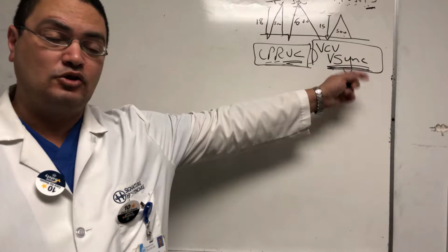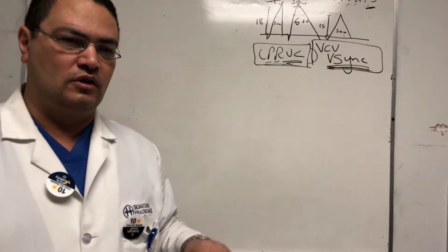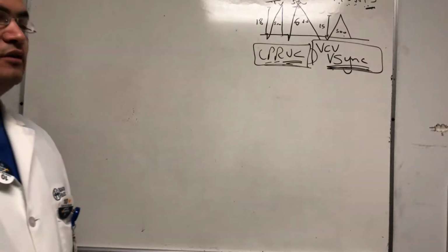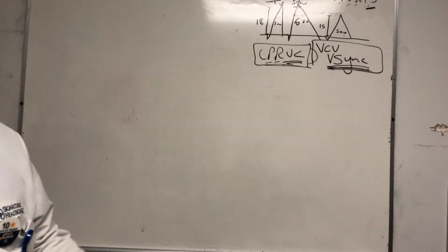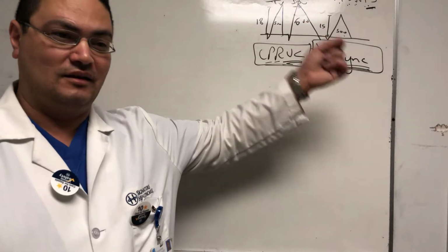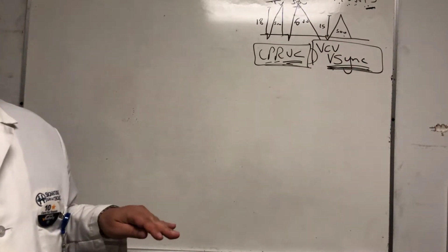It's not pressure control because you can't control the I time and all this. You can just control the way that the breath is being given. So yes, when you order VCV, you are actually getting VSync, unless you go and cancel this. There is a way to cancel this and give classic VCV. So nobody uses the bellows anymore in Brockton Hospital.